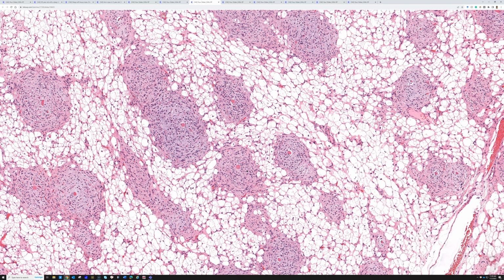One, I like to have the swirly, whirly pattern that you see in meningiomas and in perineuromas. I just like that pattern morphologically for some reason. The other one is that one of the very first papers I participated in as a resident was about dedifferentiated liposarcoma with meningothelial whorls. So this case is near and dear to my heart because of that memory.